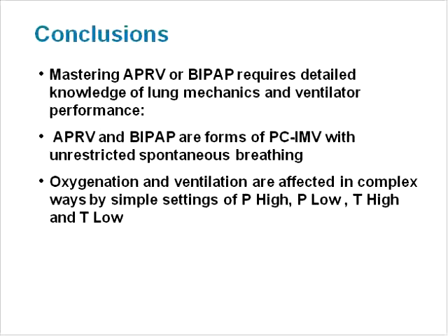The important thing to remember is that the so-called pressure releases are preceded by pressure rises, and the two comprise mandatory pressure control breaths that can be associated with large tidal volumes if care is not taken to assure appropriate settings. Finally, oxygenation and ventilation are affected in complex ways by the deceptively simple settings used in bi-level modes, and different ventilators perform differently with the same settings. Despite these issues, bi-level modes may offer some unique advantages and deserve consideration for acutely ill patients. I'm going to wrap it up there, and I thank you for your attention.